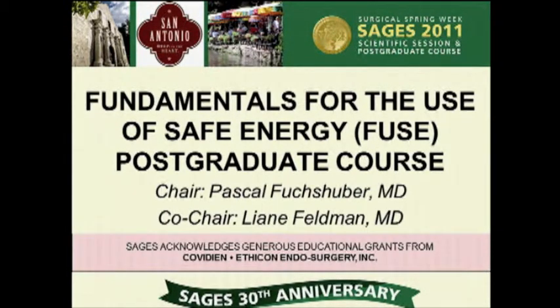The insulation doesn't matter. We're going to show you in the lab today. We'll couple multiple times through multiple layers of intact insulation. So that's I think the point: many of you actually charged a toothbrush this morning or last week, and you noticed that there were no actual electrodes on your charger. That charging goes through the insulation twice, once in your toothbrush and once at the base of the charger. So you can capacitively couple through insulation.